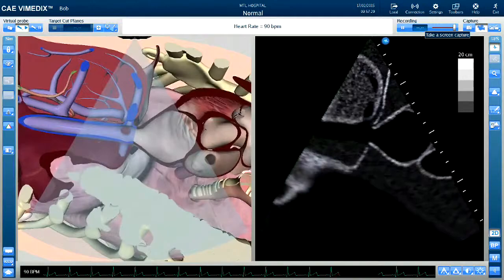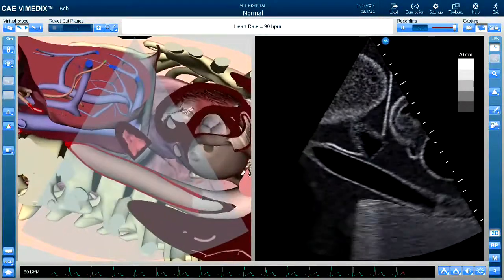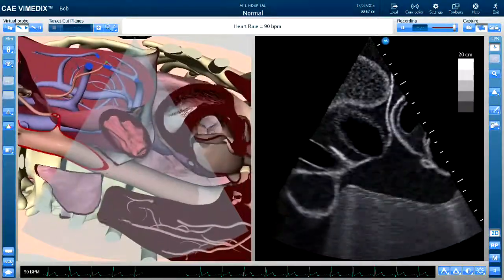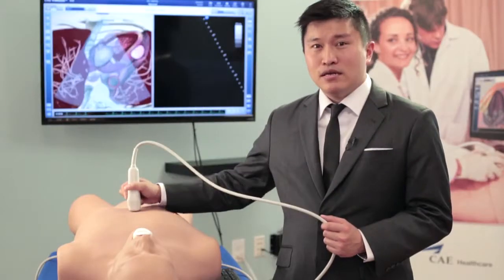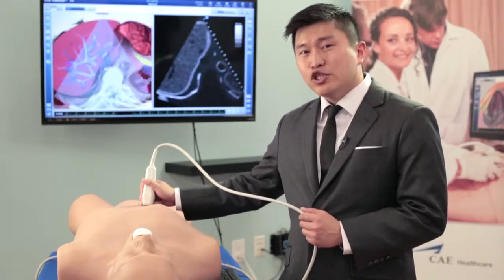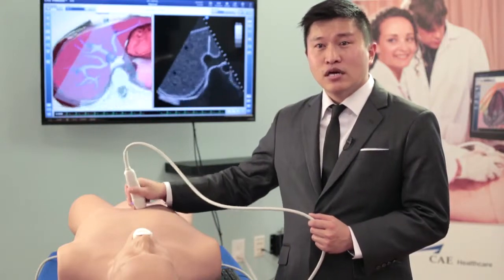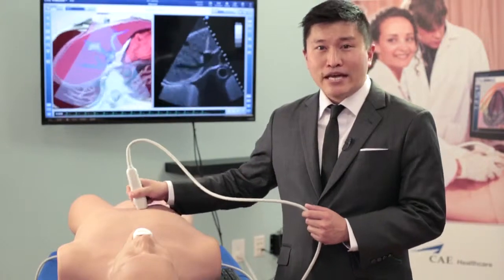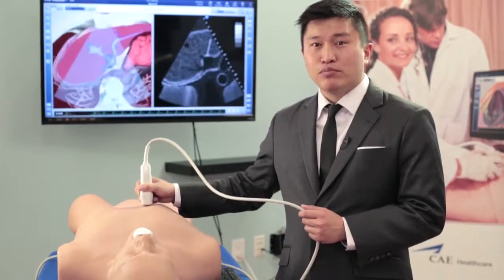The way that Vimedix works, there's a sensor in the mannequin that detects the positioning and the orientation of the probe. As you move the probe on the mannequin, in real time, the images on the software interface react immediately and instantaneously to any movements, angulations, or manipulations of the probe.